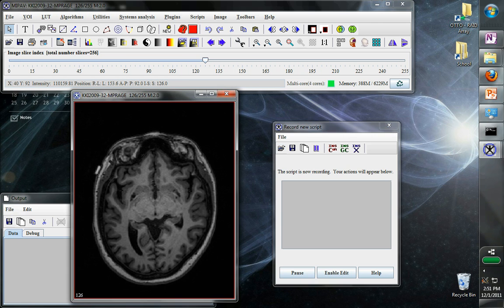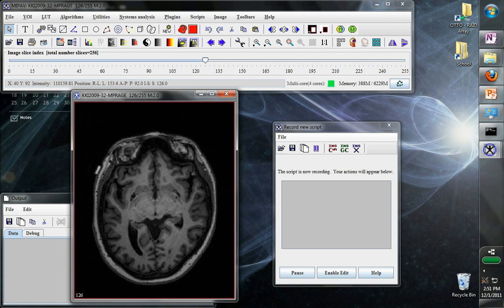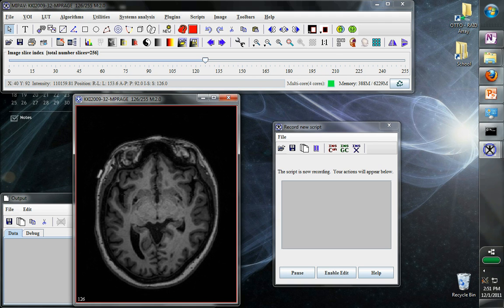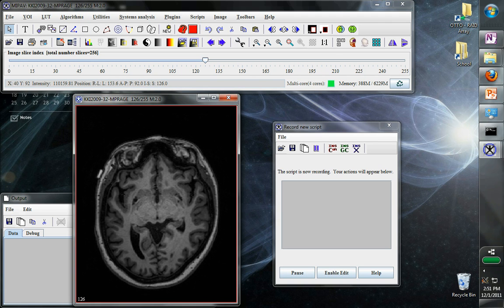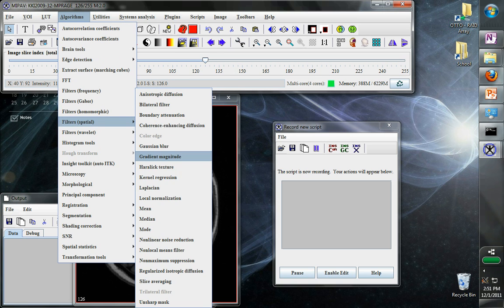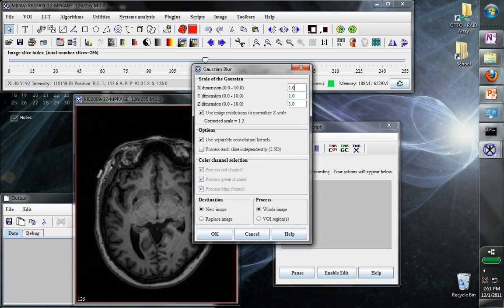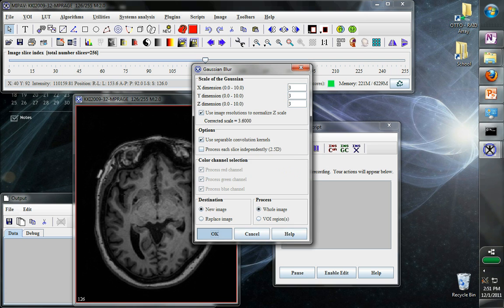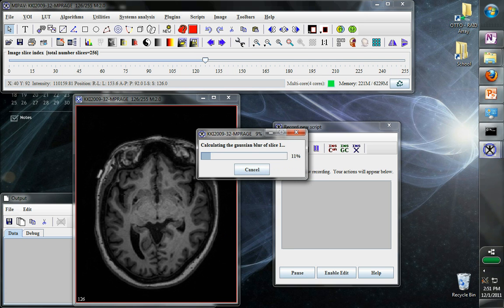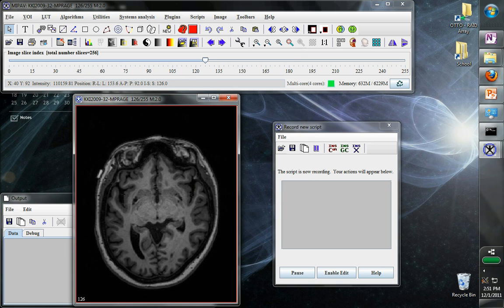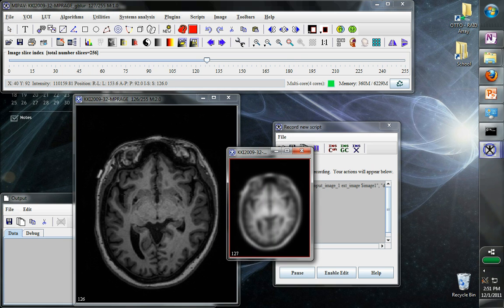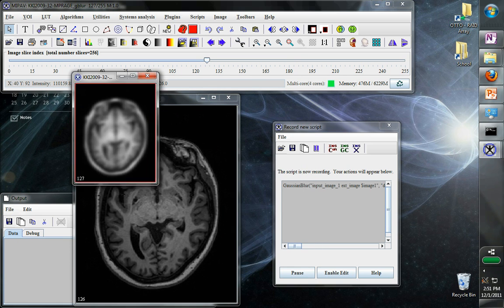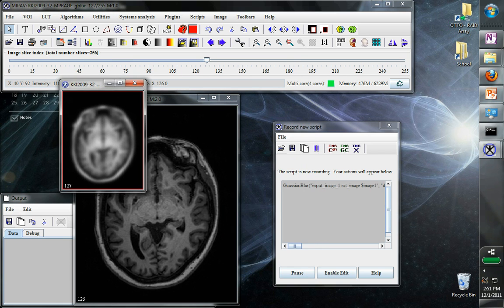So here is the image that we want to show MiPav what we're going to do on. And then we can go here to algorithms, filters, spatial, Gaussian blur, and just blur the image. And so we can let it do that.